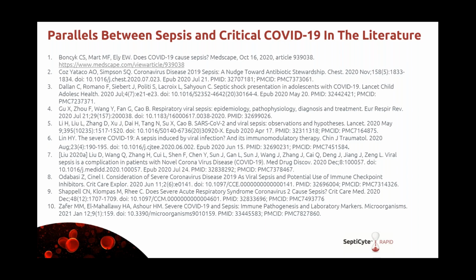The bands at least put you in the general role of band 3 patients have a high risk, band 1 patients are low risk, and those band 2 patients, in conjunction with other tests, one can determine whether one needs to intervene with antibiotics and/or appropriate antivirals if necessary.